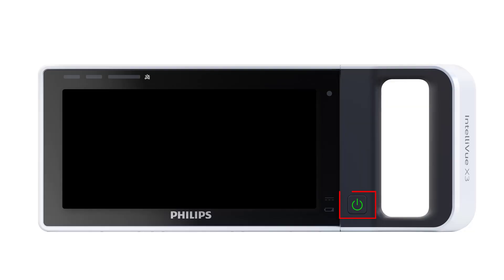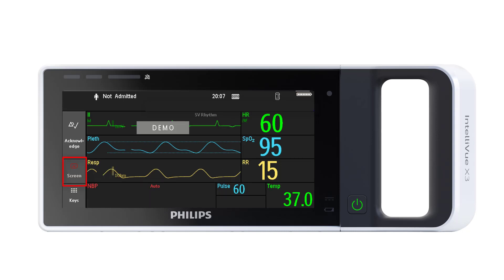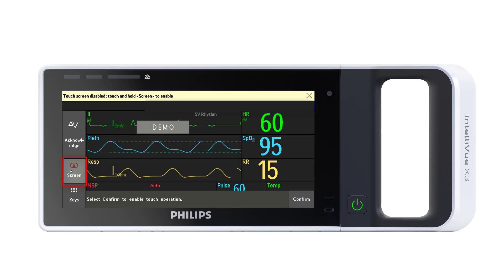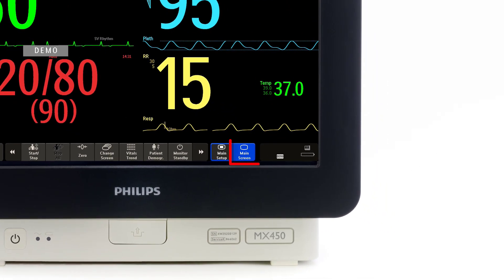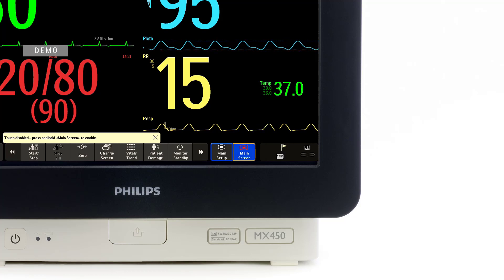To clean the touch-enabled display, disable the touch operation by switching off the monitor during the cleaning procedure, or by touching and holding the screen key on the X3 or MX100, or touch and hold the main screen key on the larger Intelliview monitors. A padlock symbol will appear on the key. Touch and hold the key again to re-enable the touch operation.